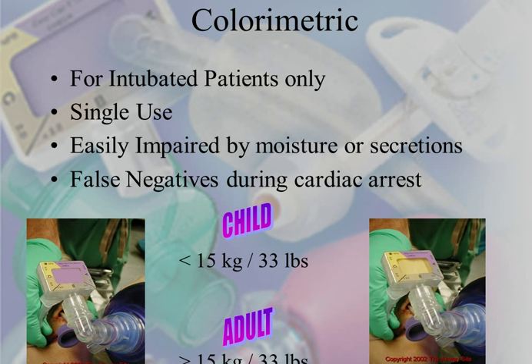Remember, for colorimetric, it's not out of the question if that's all you have available at the time. You can only use it for intubated patients. You can't use it for a patient that's just sitting there, non-intubated. Definitely single use. They're easily impaired by moisture or secretions, whether it be vomit, or if they get sodium bicarb or something else on them, it's going to give you bad readings. It's basically going to get on that litmus paper and destroy it. And it gives false negatives during cardiac arrest.